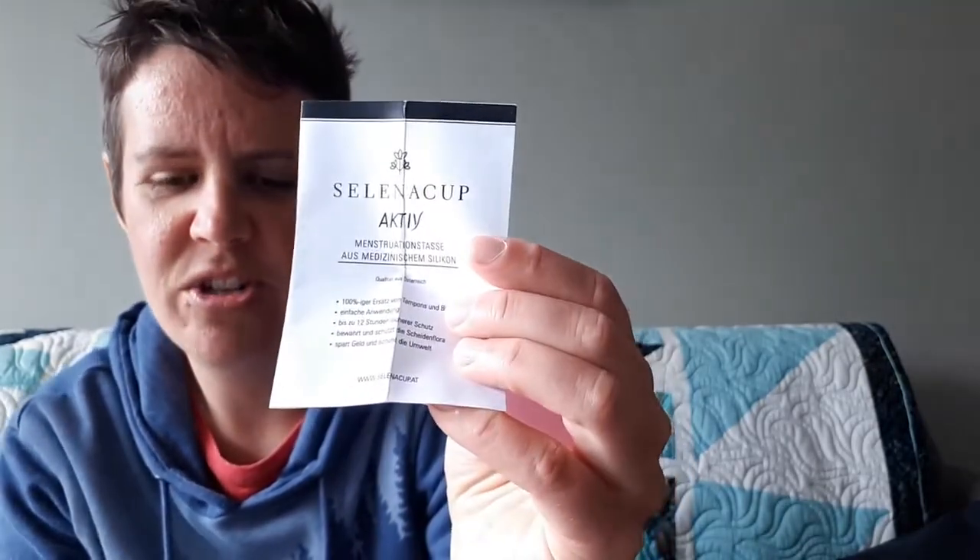Alright, so let's take a look at the active medium. Everything is the same — there are some instructions in German for both of them, and this is the active cup medium. You can see the sizes: the small one is a little bit softer. You can see the regular one is quite a bit squishier than the active one.